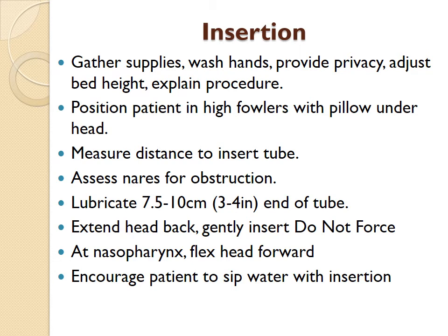Now, should you meet resistance, pull it out, allow the patient to rest, attempt to insert it again. If necessary, try the other nares. Now, if they're just giving you a rough time, you don't have to take it all the way out. Explain to them that the procedure is uncomfortable, and it's going to be a little uncomfortable while it's in there, but that it is there for their benefit.